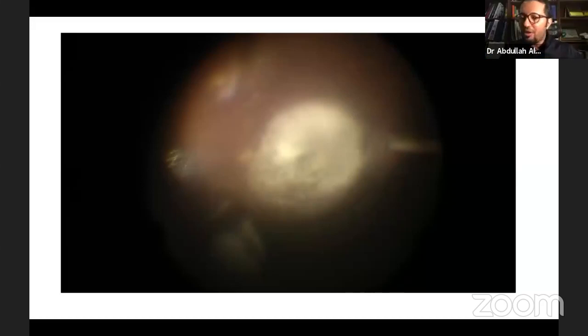I'm not talking about the PVD all over. I'm talking about a small island of cortex remnant of the vitreous over the macula only. So yeah, you can still do that just by aspiration. By aspiration, yeah, it pops off by itself. And do you agree the small gauge is easier and better than the big gauge in this technique, or no?